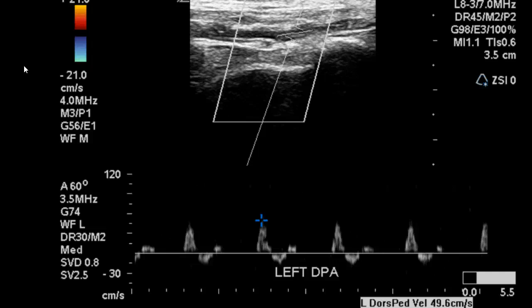And then to the foot, we can see clearly that we have triphasic waveforms all the way to the ankle. So that being said, what would you give as your final impression? We could simply say that bilaterally this is a normal lower extremity arterial duplex with normal hemodynamic findings.